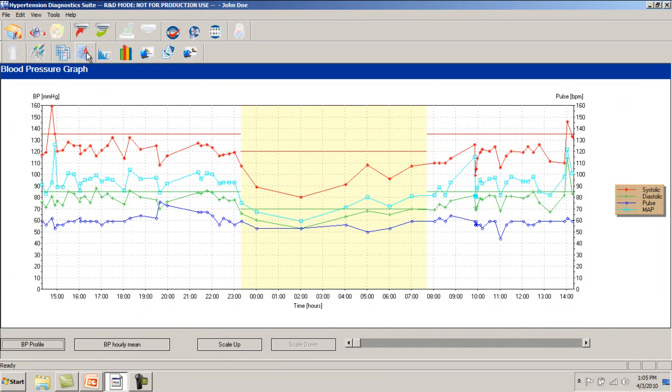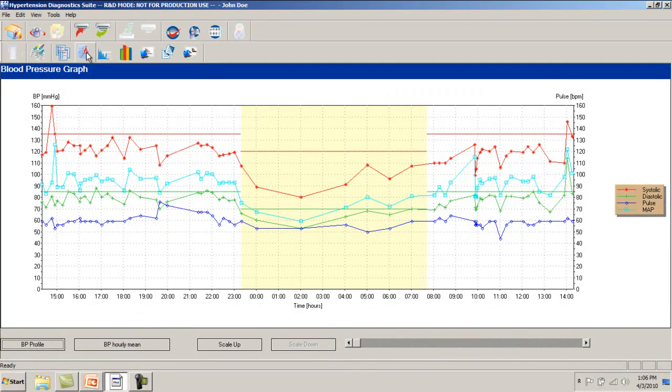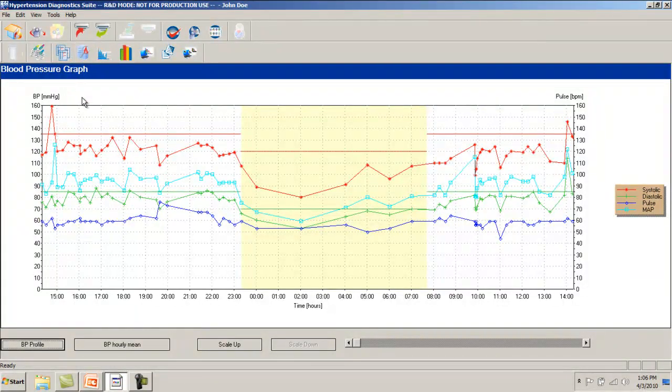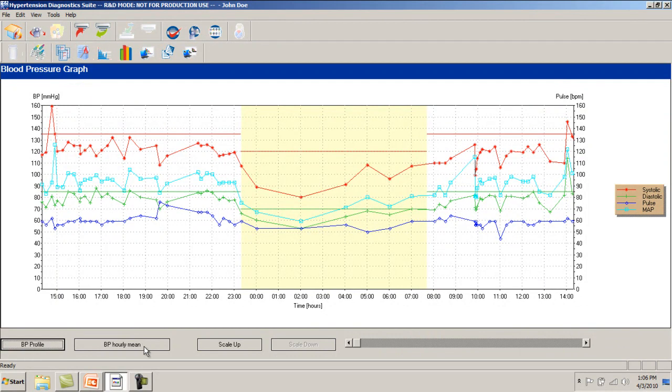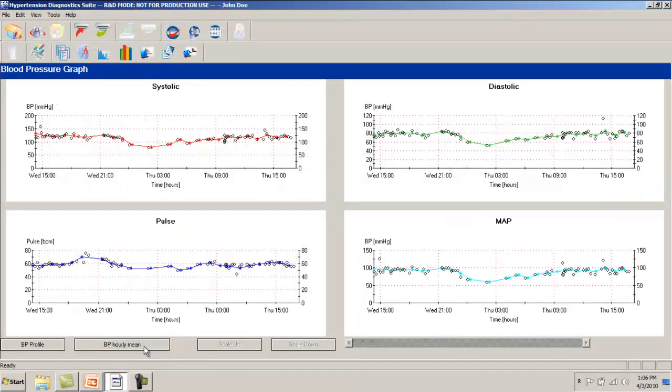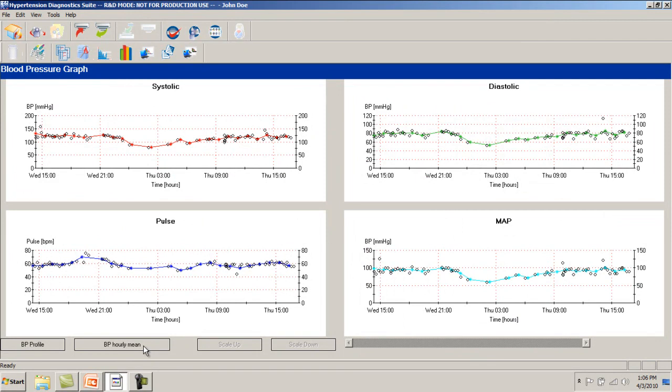The graphical view, including graph type and colors, may be customized in the Software Settings menu. Additionally, it is possible to view the hourly average graphs for the systolic, diastolic, pulse rate, and mean arterial pressure.